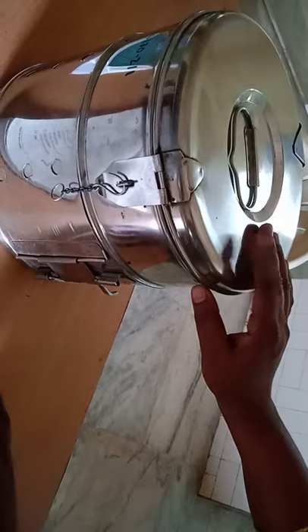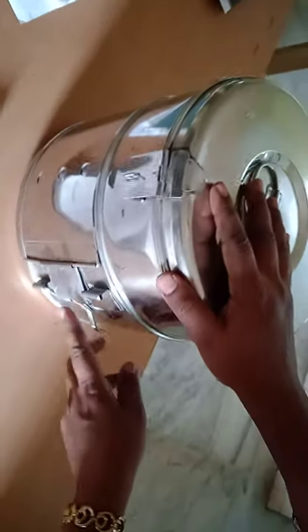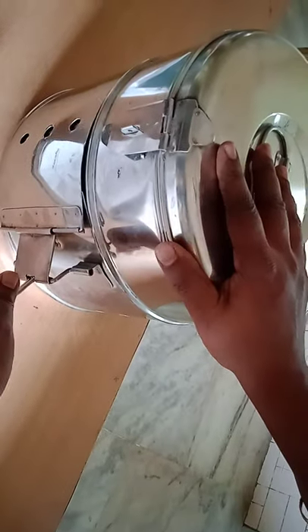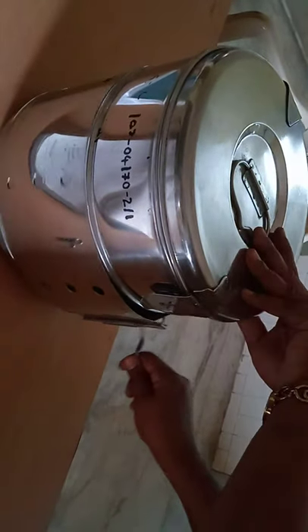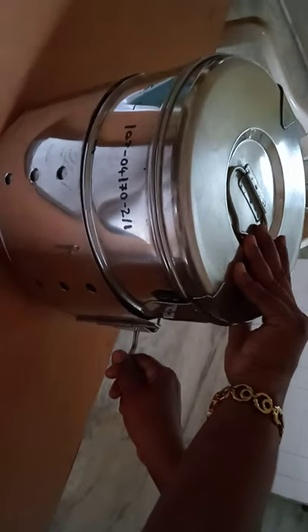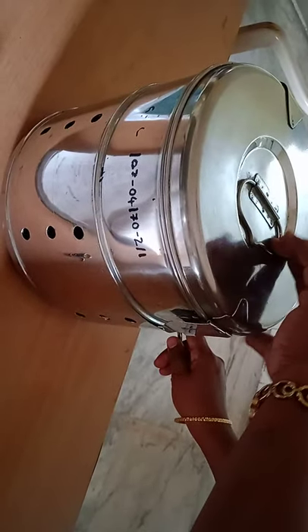Here you can see a metal drum. The locking system is visible, and this is the lid of the drum, made of stainless steel. Here you can see the hinge — like this, it will open. You have to shift it. Perforations are given to pass steam through the metal drum. When you move the hinge, it opens and closes. During sterilization, keep the perforations open; after sterilization, close them like this.